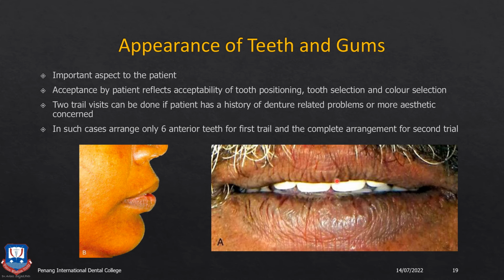So all these things also need to be verified during the try-in appointment. After all, technicalities are not something which the patient is aware of. As far as he is concerned, he mainly looks for aesthetics and function.